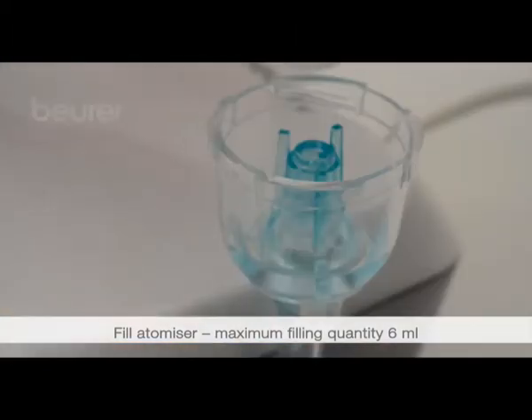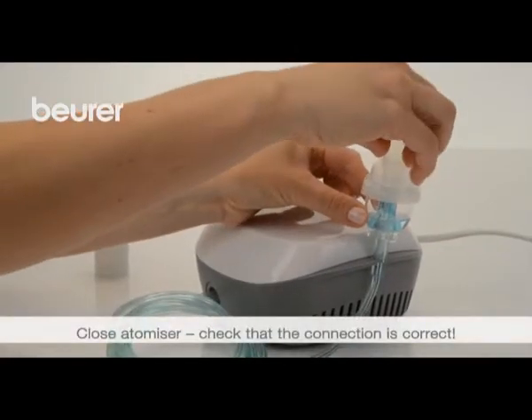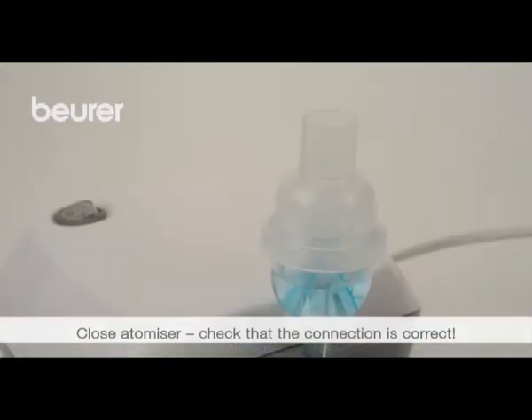Fill with an isotonic saline solution or with your liquid medication. The maximum filling capacity is 6 milliliters. Close the atomizer by screwing the top back onto the medication container.